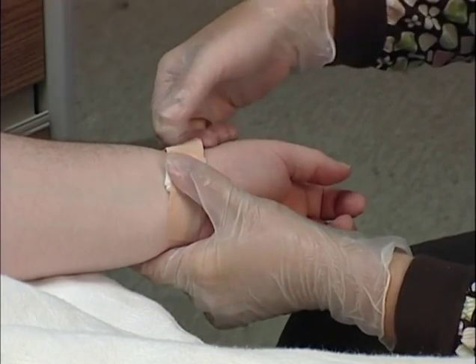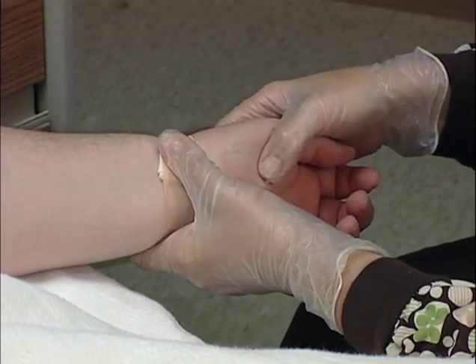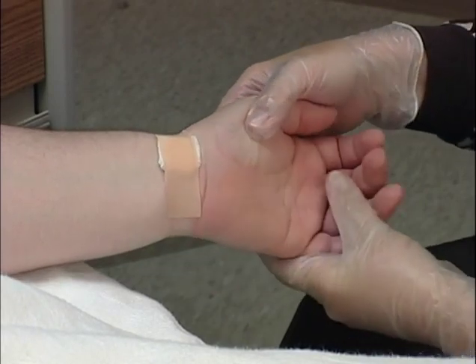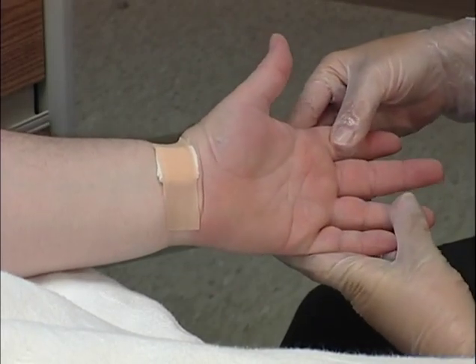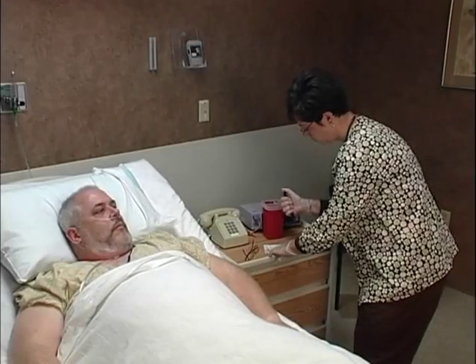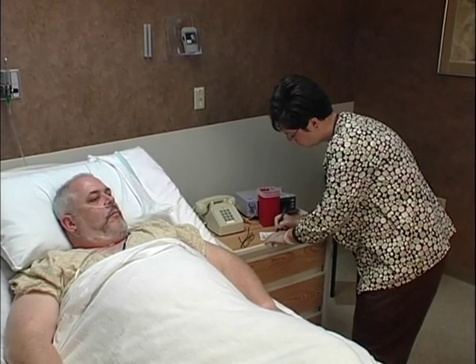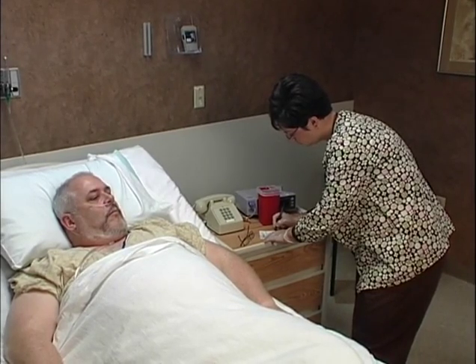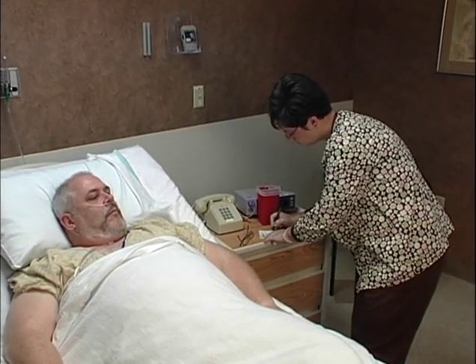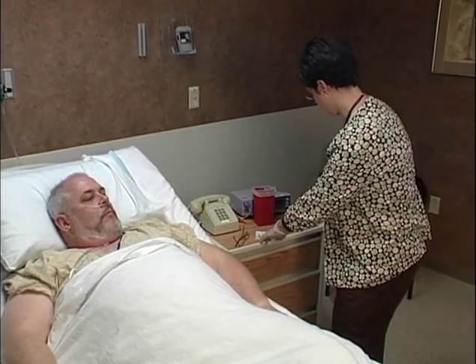When bleeding has stopped, cover the puncture site with a pressure bandage. Assess the palm for appropriate coloration and report any abnormalities. Alert the physician or caregiver if hemostasis is prolonged. Document all relevant information on the patient's requisition form as required by your facility's policy, such as ventilator settings, oxygen therapy, and the results of the Allen test.